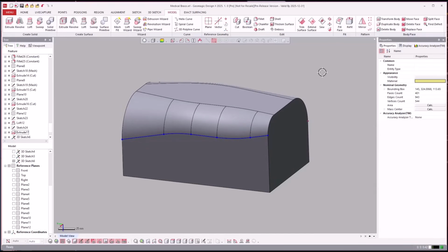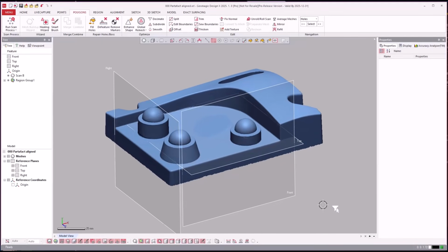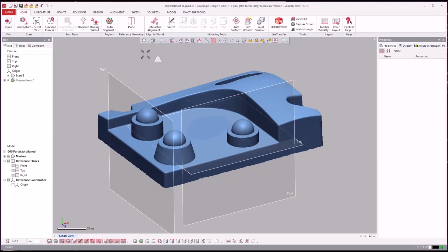Now, what I wanted to do also is just highlight another workflow within the DesignX paradigm as well. It's a little bit off topic here. One thing that I get a question about is the live transfer functionality. So if I just come over here and grab this part, normally the workflow that we show often on this webinar is I either model everything in here and save it out as a step file to go manufacture it. That happens quite often. Or I model everything in here and live transfer it over. So that's another popular workflow in here.